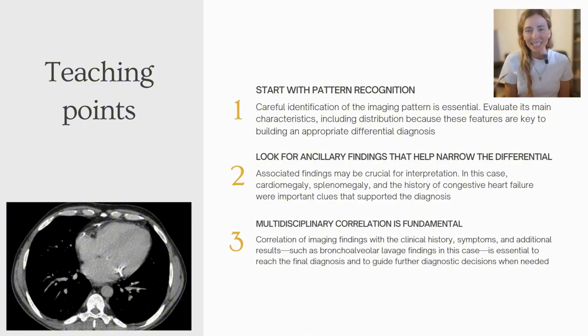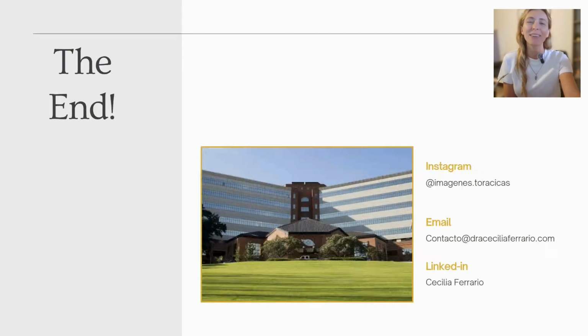And the final teaching point, as most of you know, multidisciplinary meeting and correlation is fundamental. Correlation of imaging findings with the clinical history, symptoms, and additional results, such as bronchoalveolar lavage findings in this case, is essential to reach the final diagnosis and to guide further diagnostic decisions when needed. And with that, this is the end of case 0 of Radiology Beyond Borders.